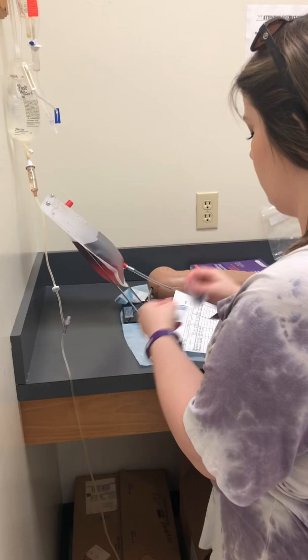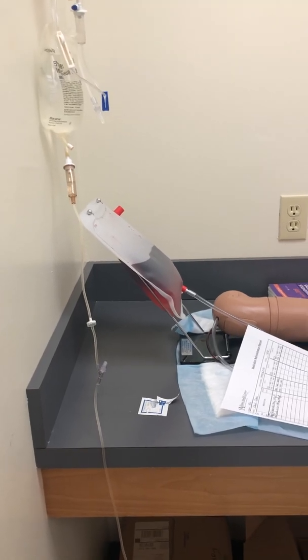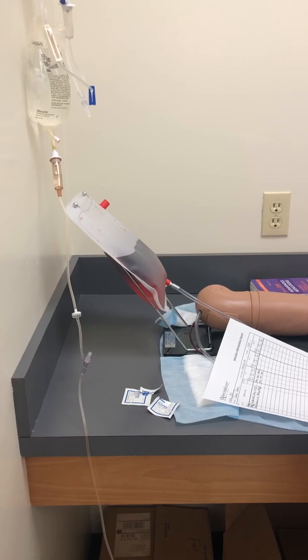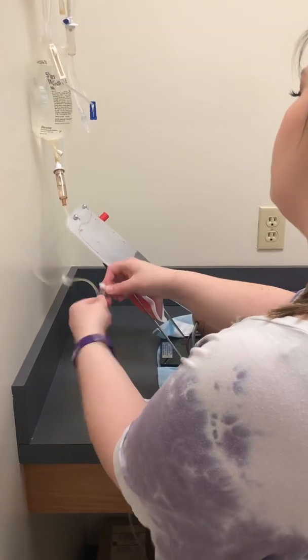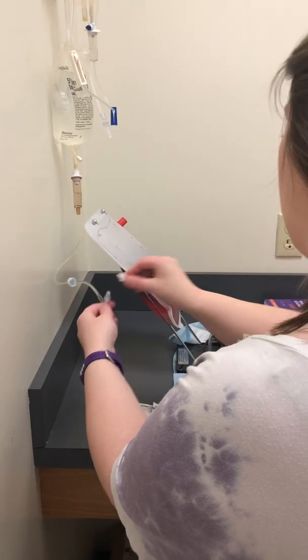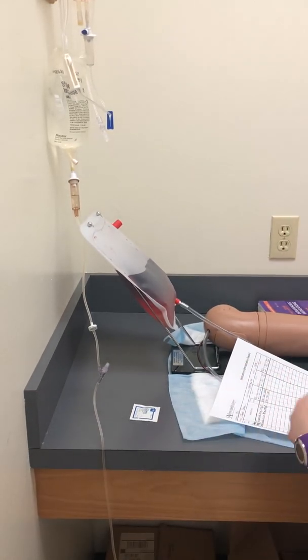Okay, and now I'm going to clean the port, which is going to be the one closest to the bag, for 15 to 30 seconds. Okay, let that dry. Okay.